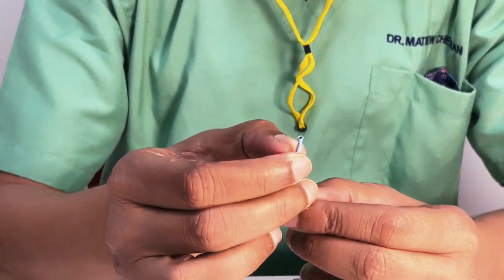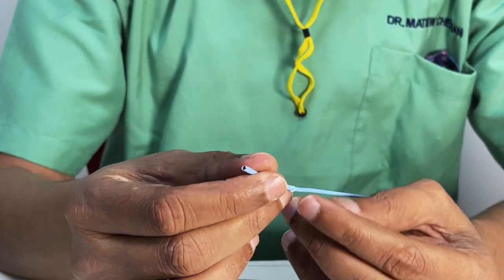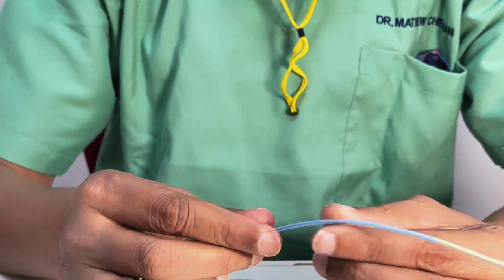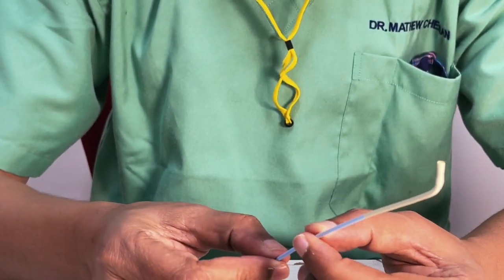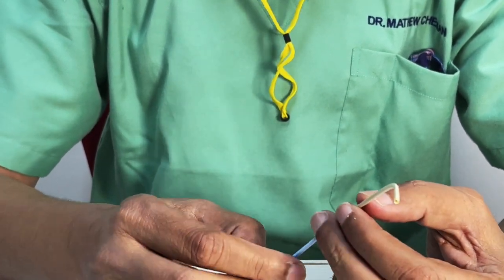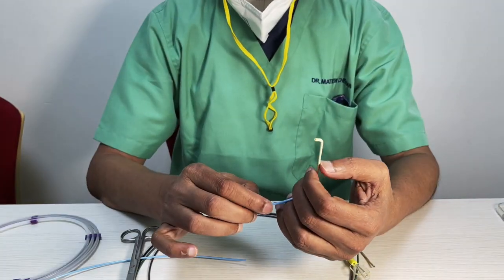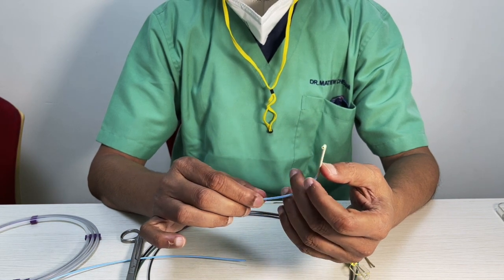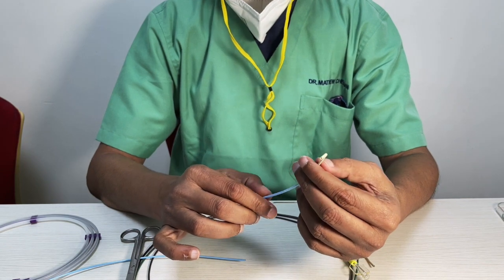Most of the companies, even today, use stainless steel as the braiding material. Now, once you use stainless steel as a braiding material, there's an advantage in the sense it gives very good pushability because the transmission is so good that you can push. Now, trackability is the ability of a catheter to go over a wire. That trackability is determined on how flexible a catheter is. And that is why these catheters were stiff, they could be pushed, but was not flexible.